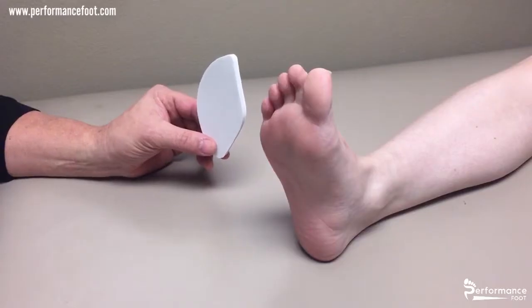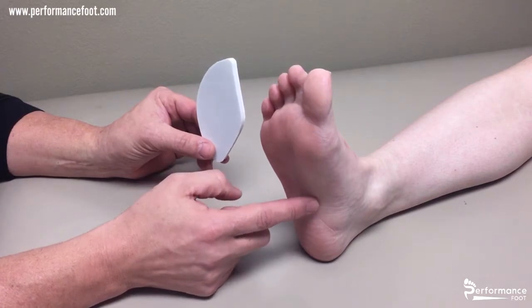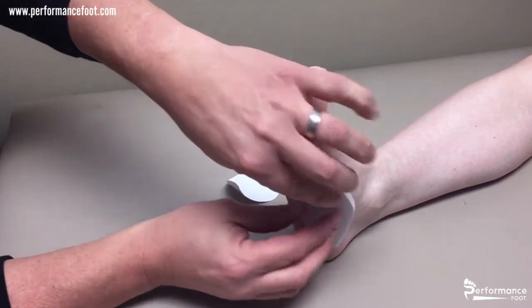This is a one quarter inch foam arch pad. It's used to reduce pain and increase comfort along the plantar fascia or the arch of the foot. To apply it, you remove the adhesive back and place it directly to the skin.